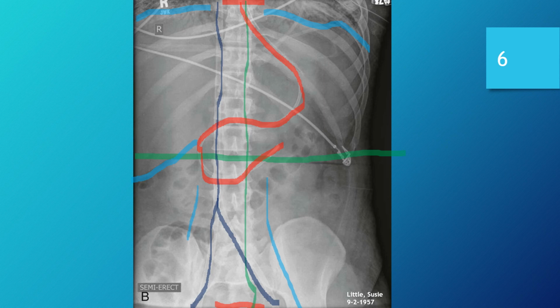That's a pretty unique artifact, and it's not one that I can say I've seen very often. So I am going to venture a guess that that's what it is, or it is the largest vessel graft I've ever seen in my career. Regardless, it is most likely internal, and there's not a whole lot we can do about that.